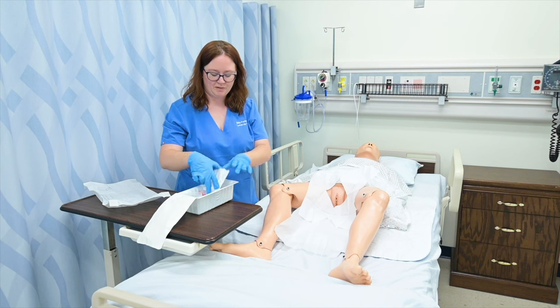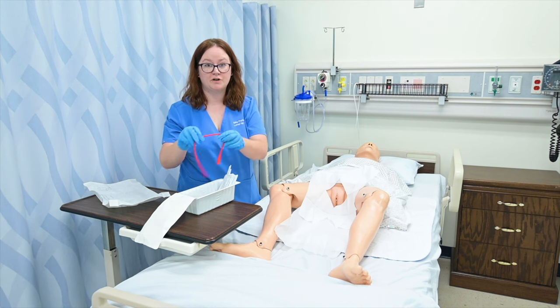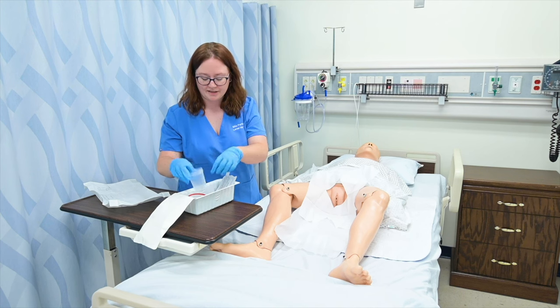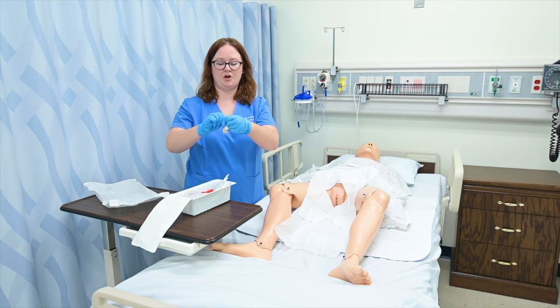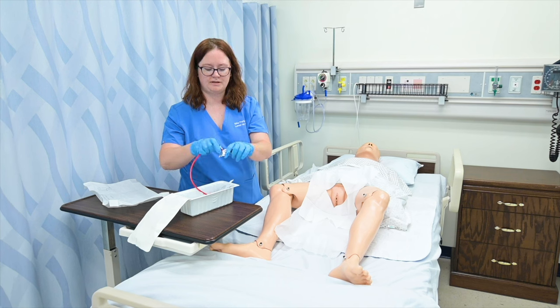I'm going to open my swabs so that they're ready. These kits are usually red with the red tubing. I've got a collection cup if I need a sterile collection. And I, of course, have a little packet of lubricant. So I'm going to go ahead and open my packet of lubricant and generously lubricate my catheter tip. Get in there. There we go.